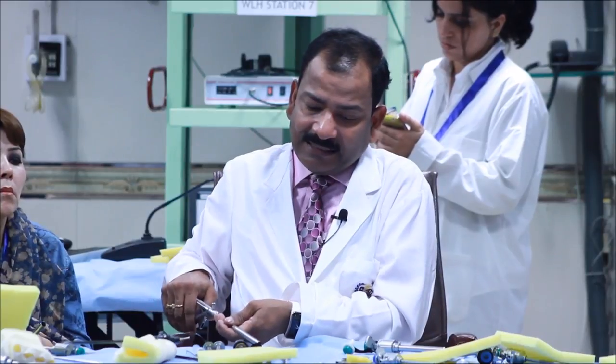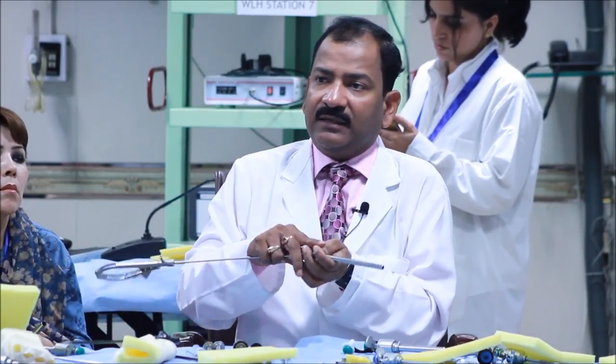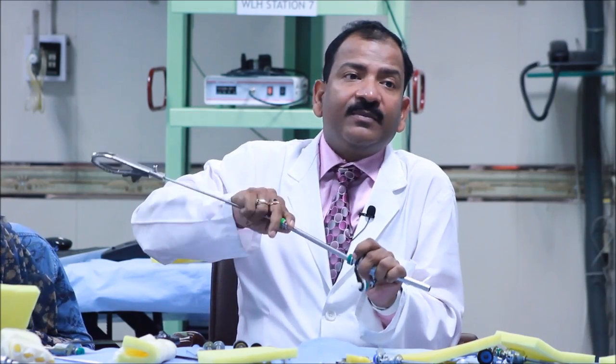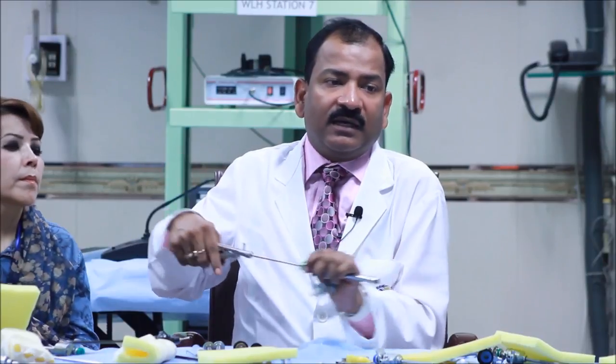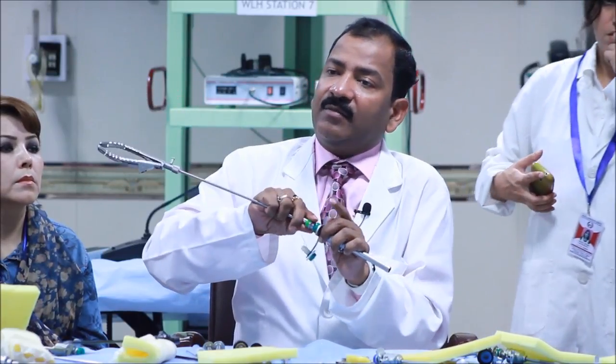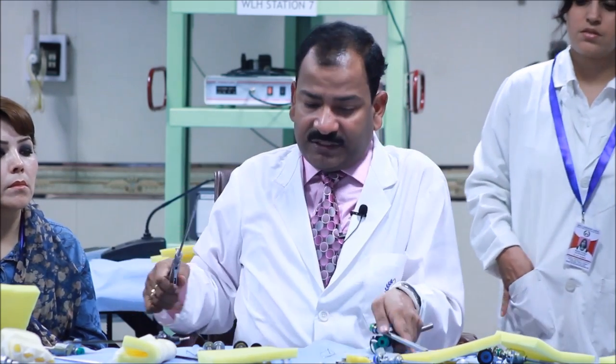Then I can catch the suture. Then I can hide the suture. And then I can hold both together. And then I can go, it will not be trapped by the valve also. And then I can perform suturing, knotting. Again, at the time of removing the needle, I will hide the needle into the reducer and then come out.